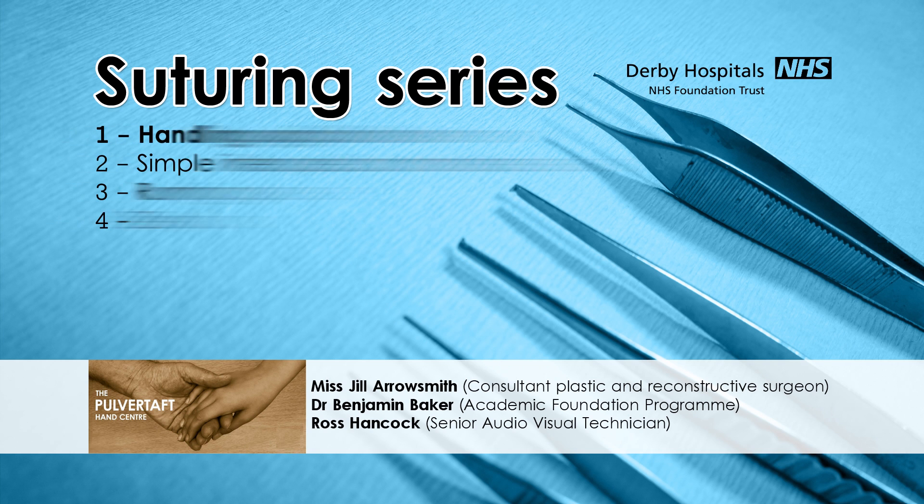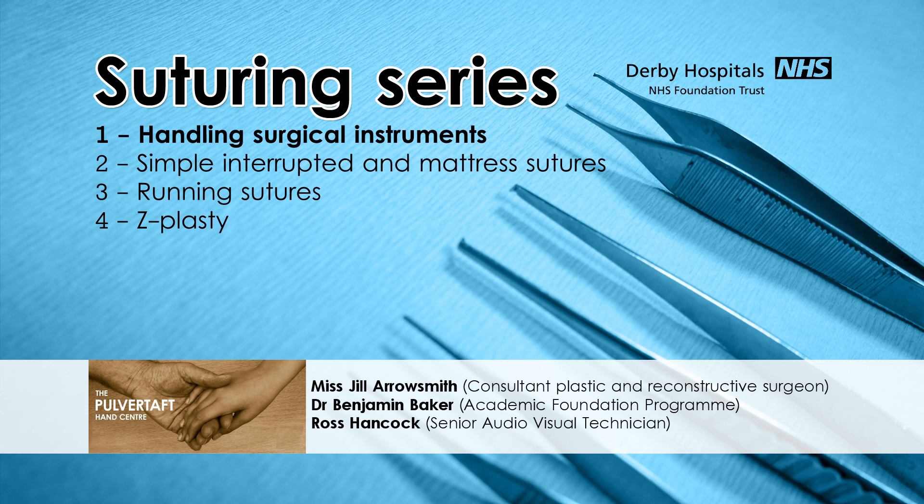Today is the first of our four podcasts about suturing techniques and we've been privileged enough to have the opportunity to demonstrate these on cadaveric tissues. These podcasts are aimed at senior medical students and junior doctors as they begin to prepare themselves for a surgical career, and the latter podcasts in the series will be useful for core surgical trainees as well. Although we use cadaveric material in our podcast, there are a wealth of materials available that can be used to practice suturing techniques at home, and we recommend practicing the techniques which we demonstrate alongside our videos.